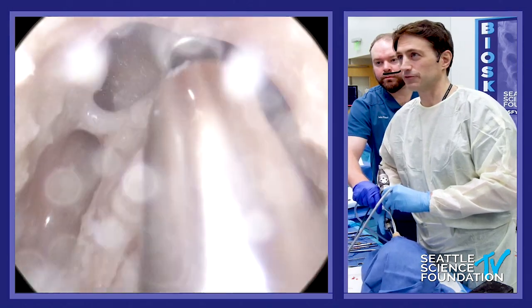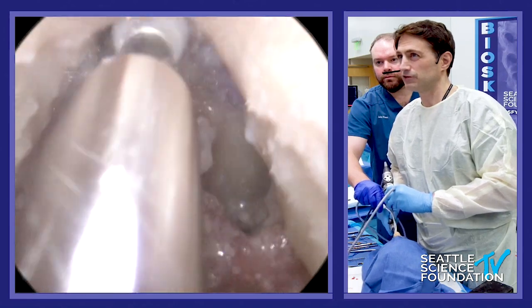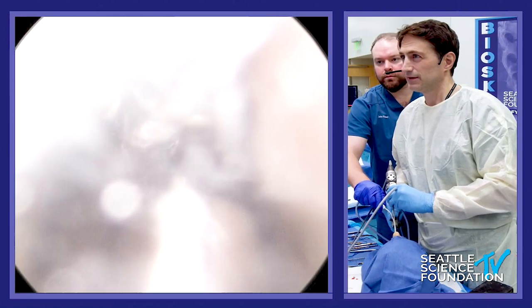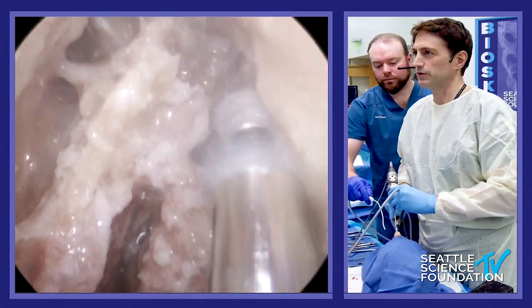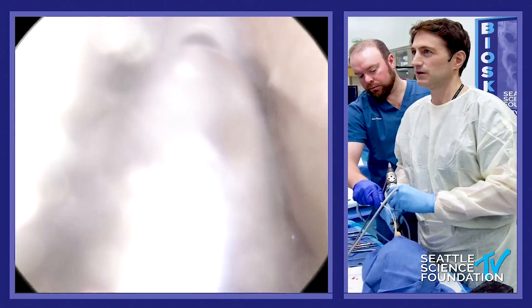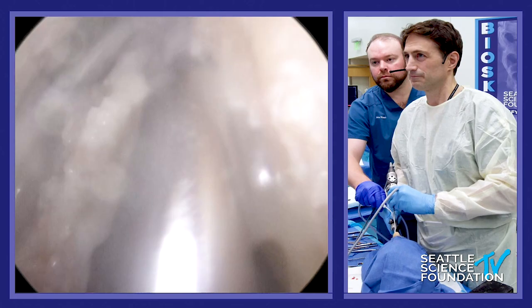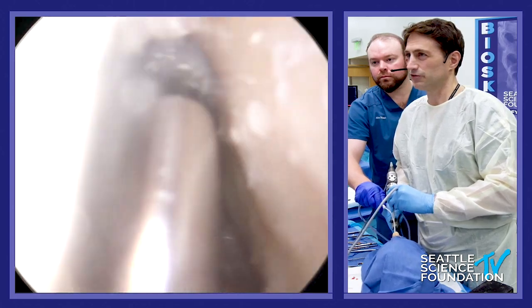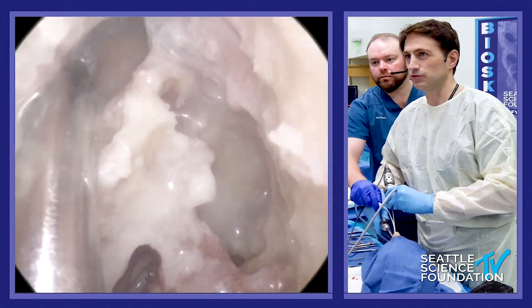Basically we've just done our Draf Three in like five minutes. If you've raised your flaps well, I like to polish off around the corners — I'll show you that in a second with an angled burr. And of course I put my flaps up with an angled burr, angled scope, and all that stuff as well.